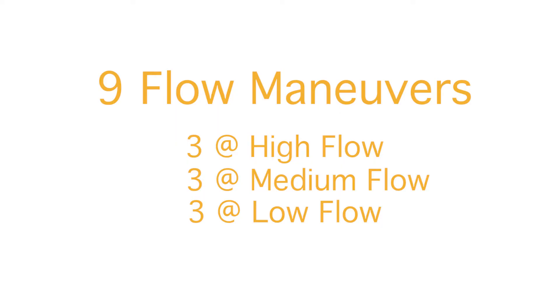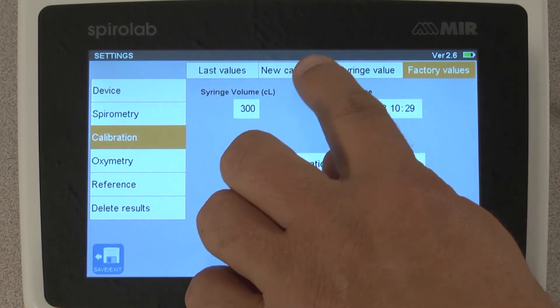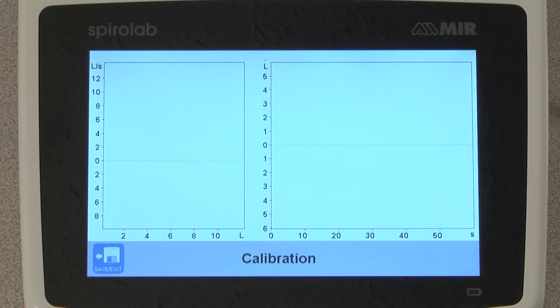Select Factory Values and tap OK to confirm factory calibration. You will be doing a total of 9 maneuvers: three at high flow, three at medium flow, and three at low flow. Now select New Calibration. This screen will show you the inspiratory and expiratory loops you will make as you do the calibration check at the three different flow rates.